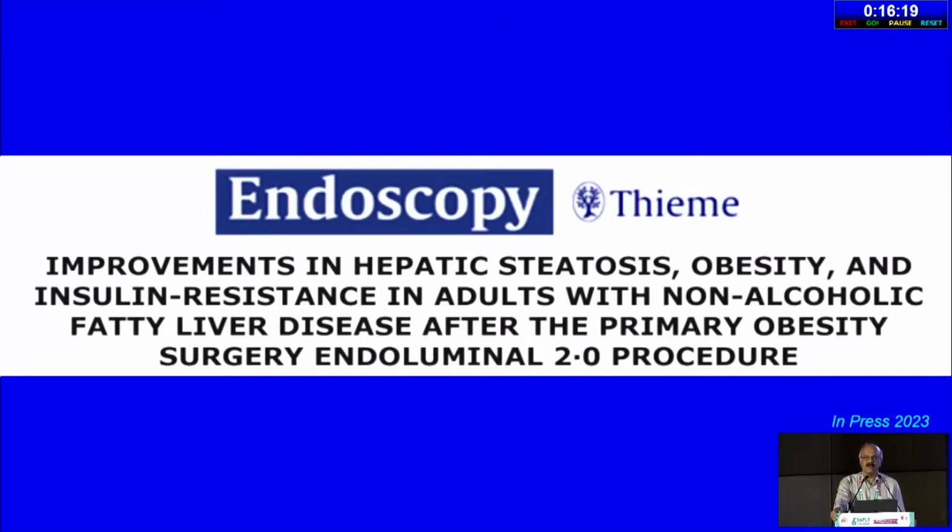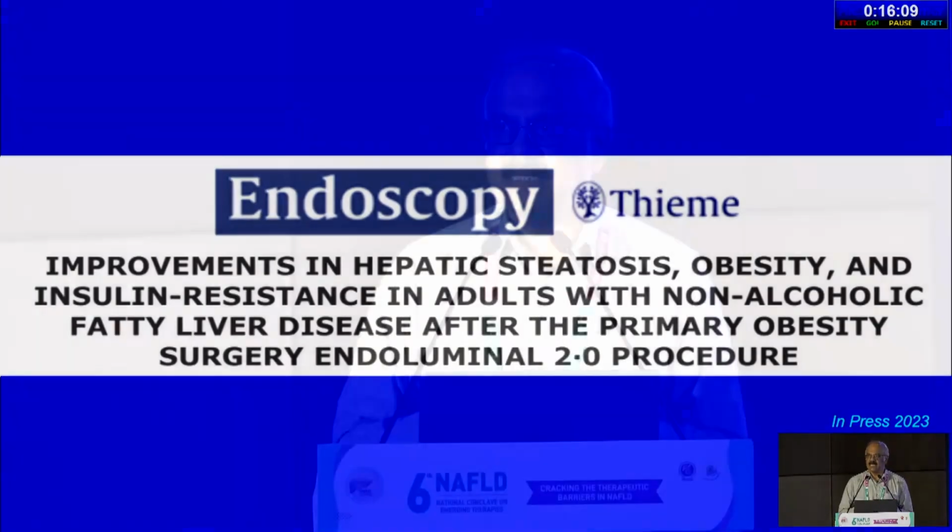This is another very interesting study, still in press, a multi-center study from Europe and US, which is looking at using the POSE technique. POSE technique is one which also is for restricting the gastric volume endoscopically, but not as much as with ESG.